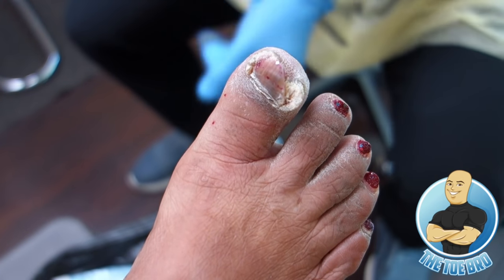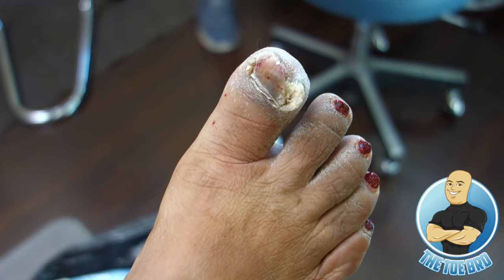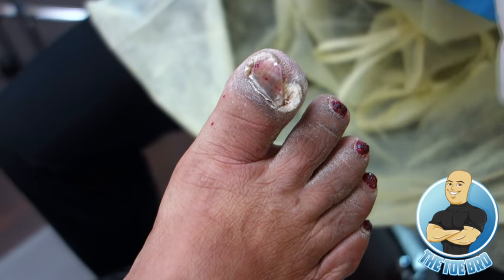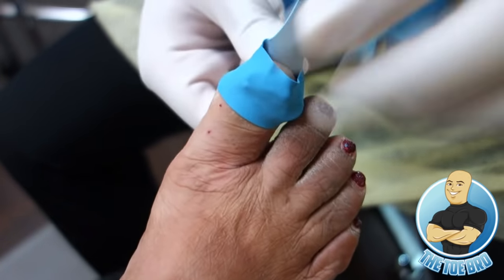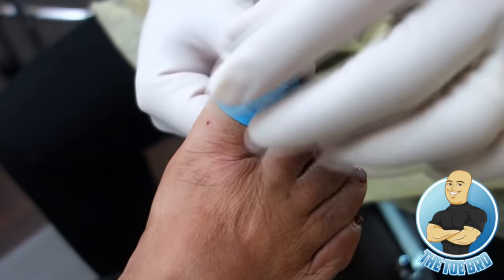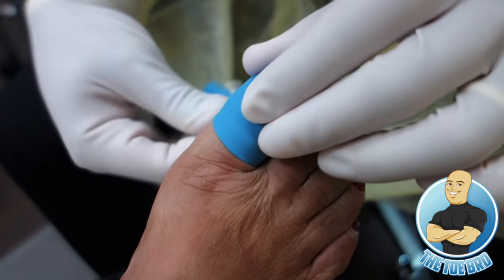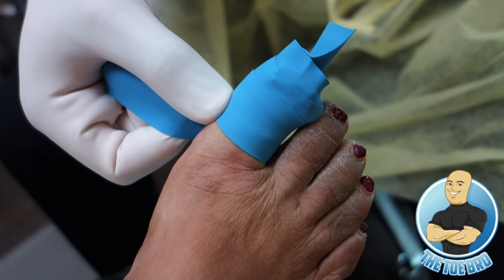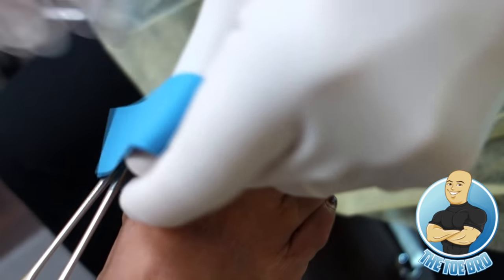Okay, so I'm gonna put on the good gloves and we're gonna get started, okay? So Tita, you relax. If you feel anything sharp, you just let me know. Okay, I'm just putting on a little elastic band around the toe, okay? This is to stop any sort of bleeding. The tourniquet is going to be very important in this procedure. Number one, warty tissue is full of little blood vessels, little black dots, and it's going to bleed really easily when cut. So if we have a lot of blood in the area, we're not going to see all the warty tissue properly. So it's very, very important there's little to no blood.